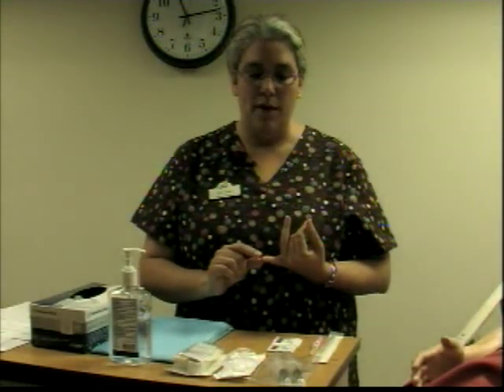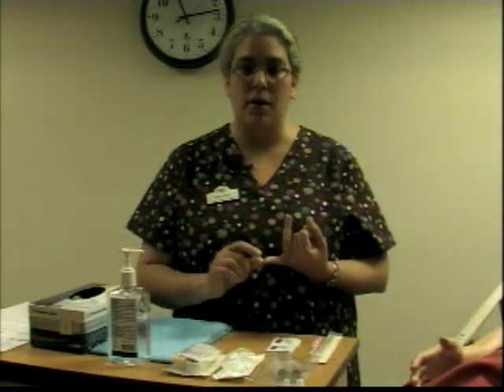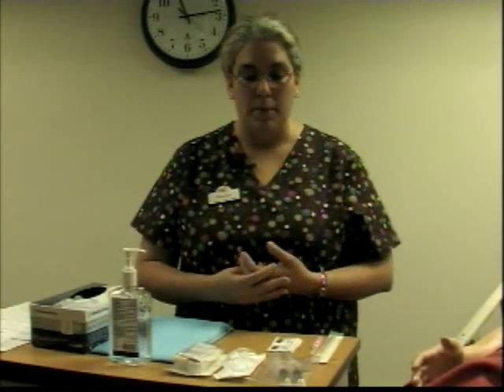You want to make sure that you know if there's a history of cancer, specifically breast cancer, specifically a client that had a mastectomy. That is one contraindication of starting an IV on a female client. The obvious one will be amputation, of course. You have to go to the other extremity.